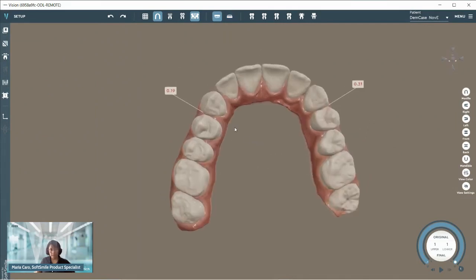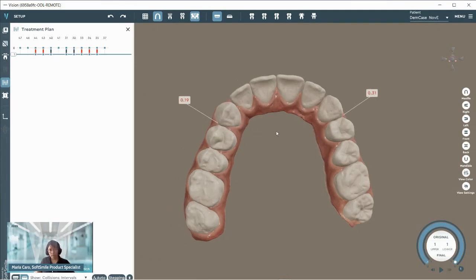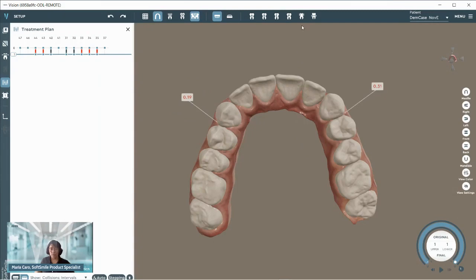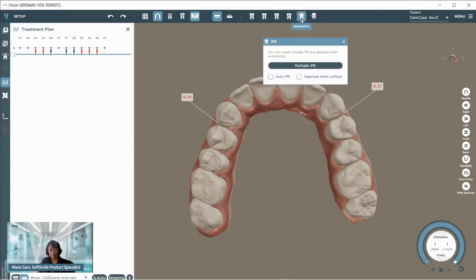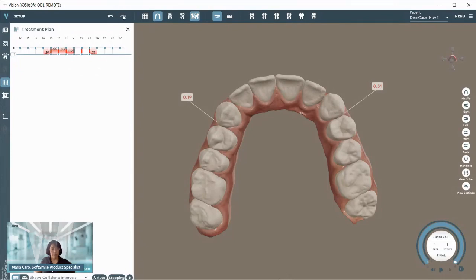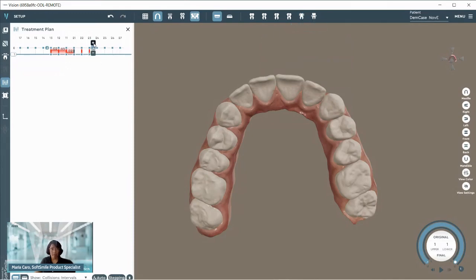Now I'll show how to execute interproximal reduction and how it's documented in the treatment plan. In this case we have no treatment plan yet; we're still working in the final position with our anteriors aligned to ideal position. We have IPR that needs to be executed, and we use the separation icon for that. We have multiple IPR buttons. When executed, the IPR shows up on the upper — for example, tooth 1.4 shows 0.2 and tooth 1.3 shows 0.4 of IPR. We can increase the value if needed or shift the interproximal reduction within the treatment plan.